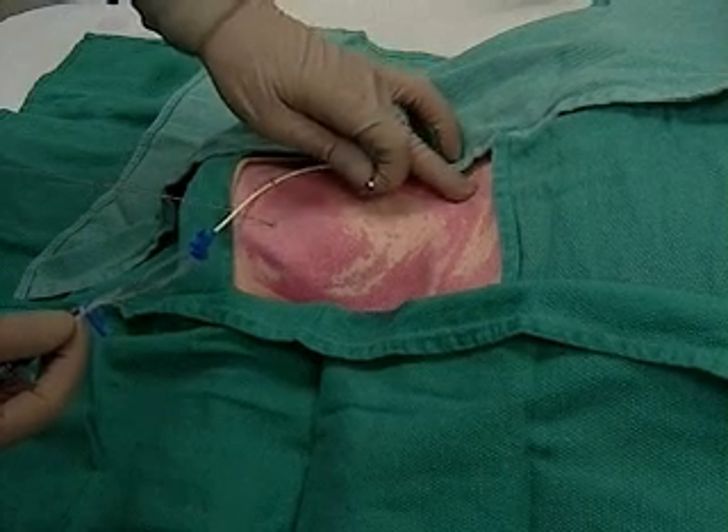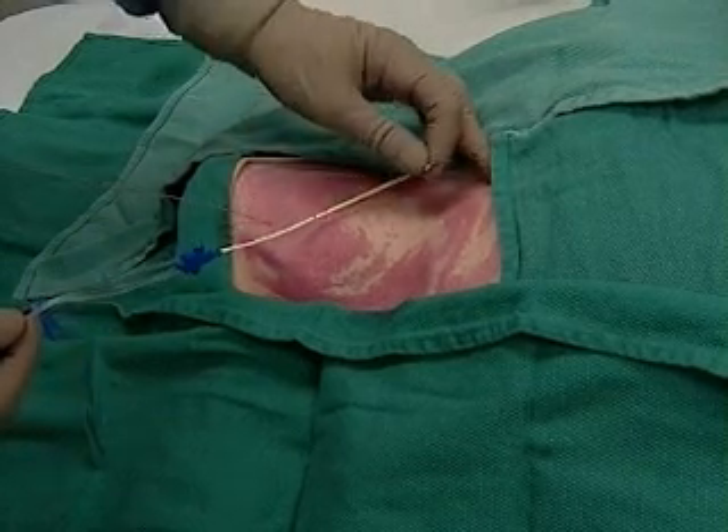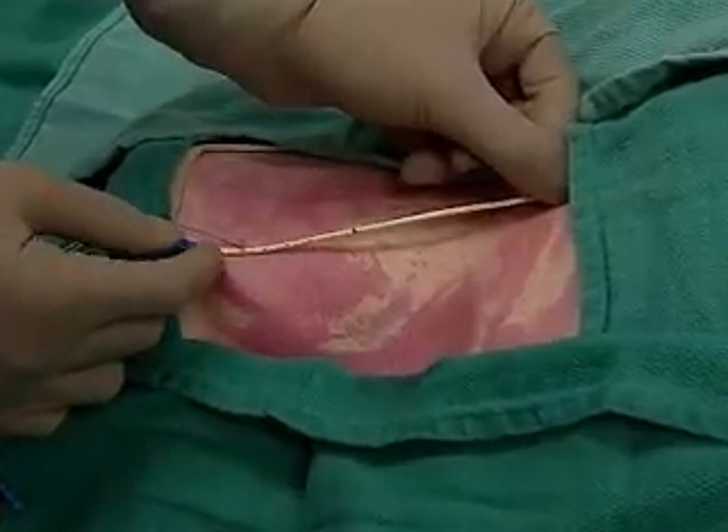Before we begin, we palpate that sternal notch. Lay the catheter tip at the sternal angle, with the other end to the needle entry point, and we can see the catheter is the right fit for this patient.